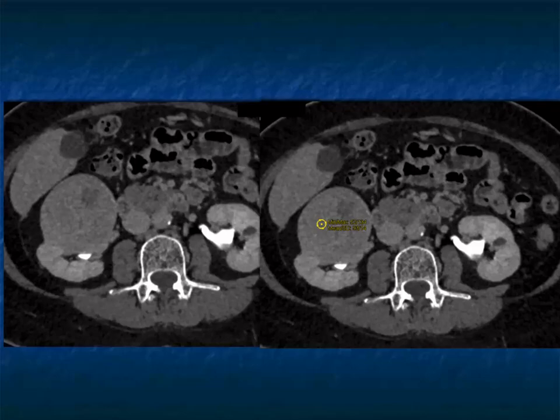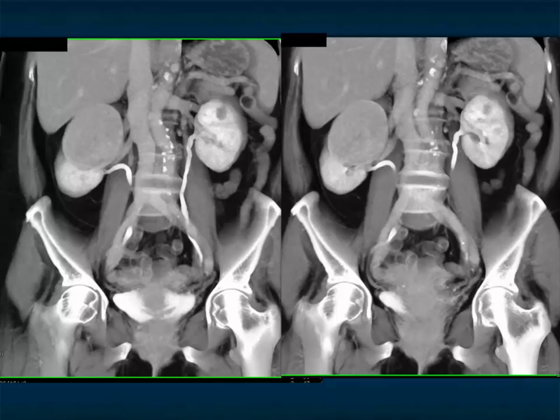It could be a papillary renal cell carcinoma, but as you mention papillary, you also should say, hey, the mass is not very vascular. It's well-defined. Yes, it could be papillary, but it could be a chromophobe as well. The one thing we could say it's not is a clear cell. So this patient would undergo a partial nephrectomy, though it is challenging because it comes very near the hilum. Here it is on the 3D mapping. Almost looks like it has a pseudocapsule.